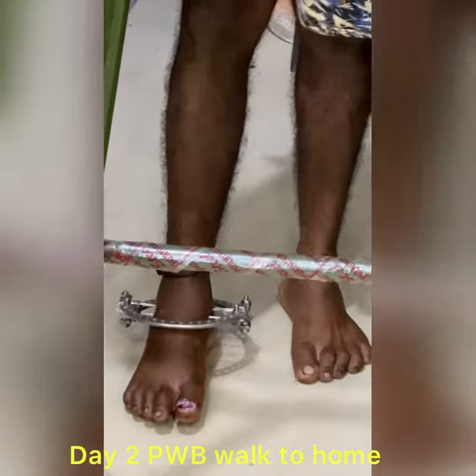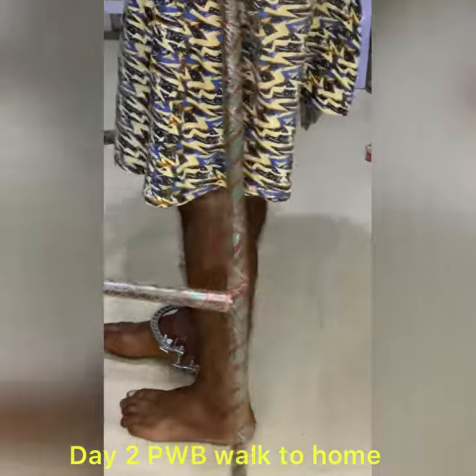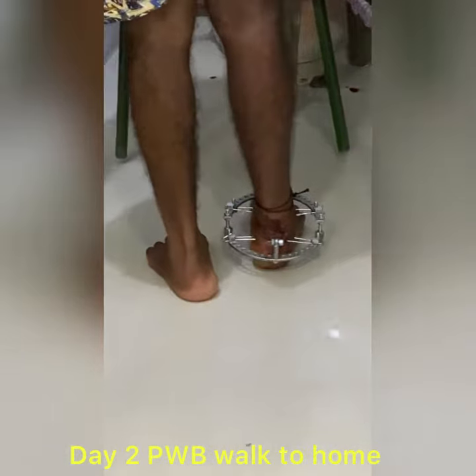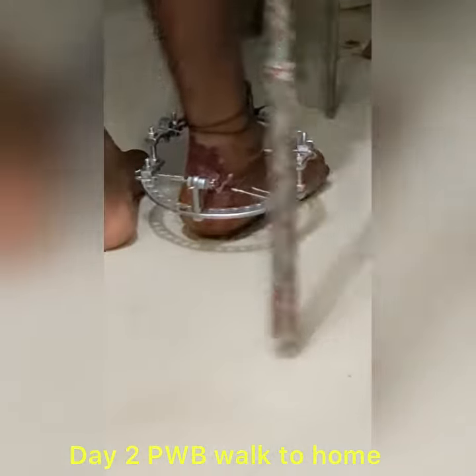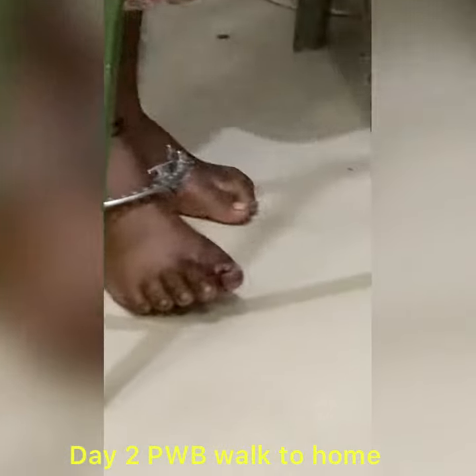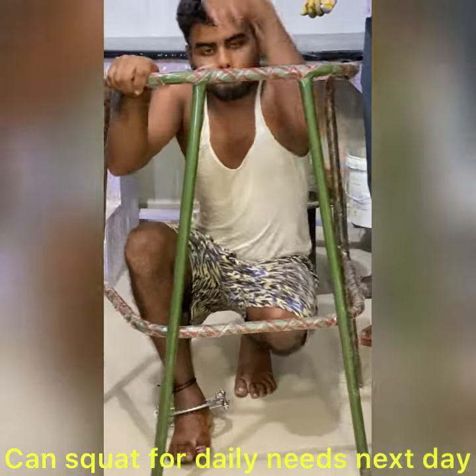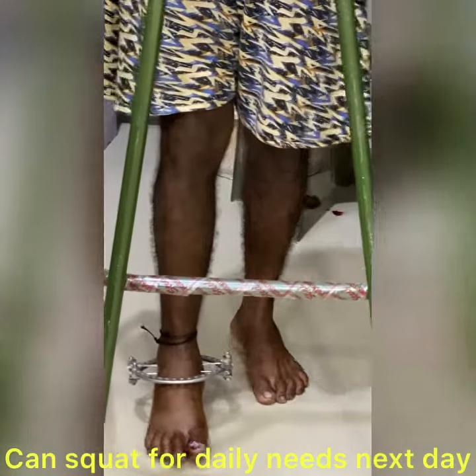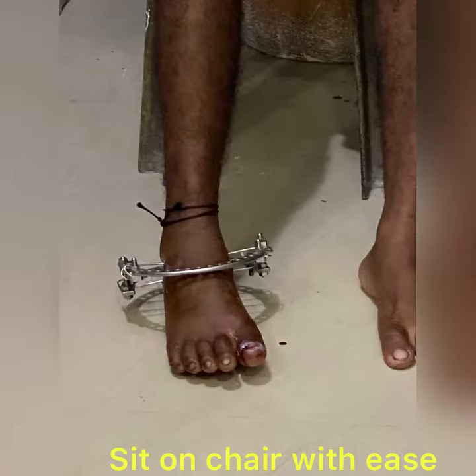You can see the patient is having partial weight-bearing walking. The patient can sit comfortably to do daily activities, with full angle movements and full dorsiflexion.